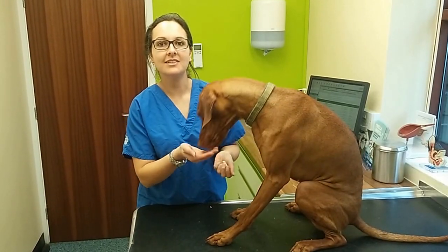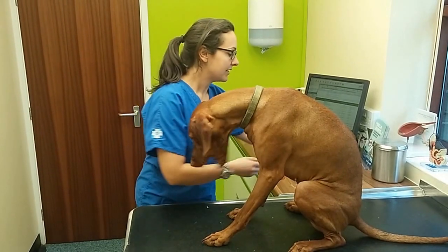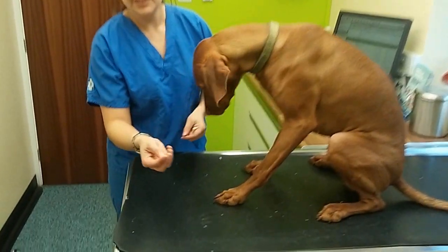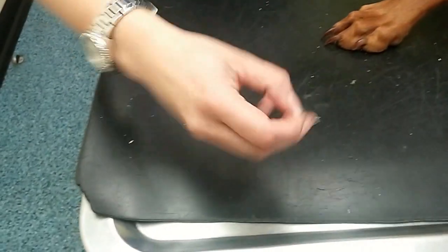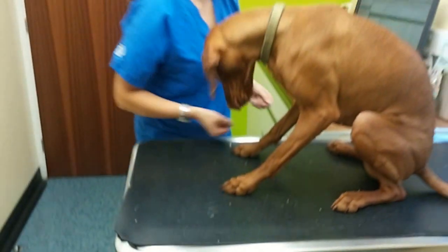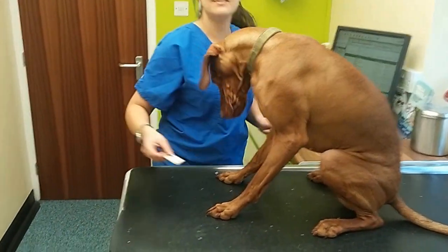Hi, this is Ruby. My name is Natasha and today we're going to talk about microchipping. A microchip is unique — it looks like a little grain of rice, and it contains a unique barcode. For example, this chip's barcode is here.